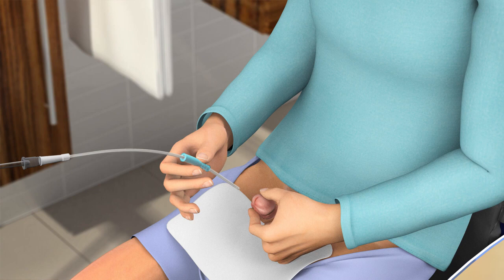To help insertion of the catheter, it is important that you relax. Position the insertion grip approximately 10 to 15 cm from the catheter tip so that you feel you can control the tip when inserting it into the urethra.